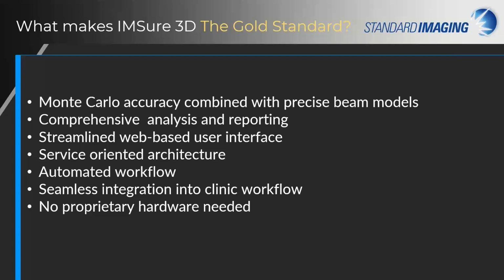When the plan QA calculation is complete, the user is automatically alerted and only needs to interact with the QA analysis and reporting tools, which I will show you later. There's no proprietary hardware to purchase. There's no expensive GPU card. It's just standard hardware that runs on your hospital's own network. So once the machine model is complete, the solution is really easy to configure, really easy to install, really easy to get up and running in the clinic. And as a physicist trying to get new technology moving forward in the clinic, that's really important.